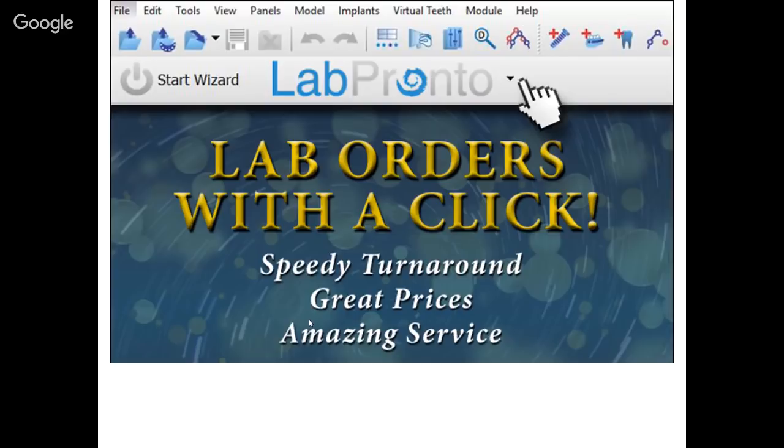Lab Pronto is all about getting it done. We know you're busy with patients, running out of the office. It's all about getting the work done. The prices are great, and the service, of course, is amazing. So those are some of the benefits of Lab Pronto. And we're going to take a look at it now in the software to see how that functionality works.